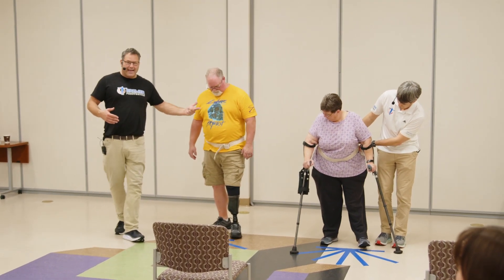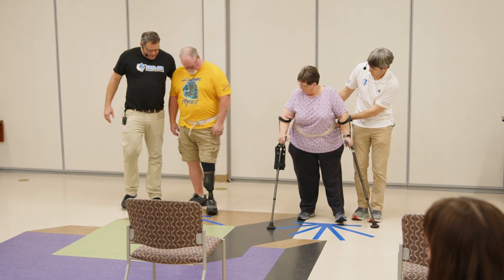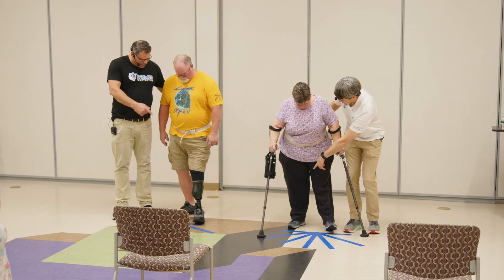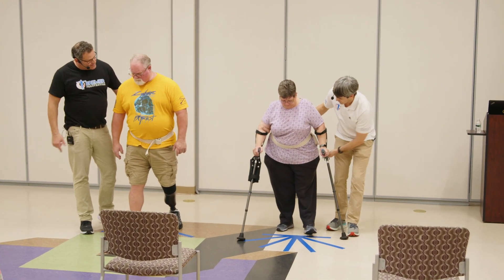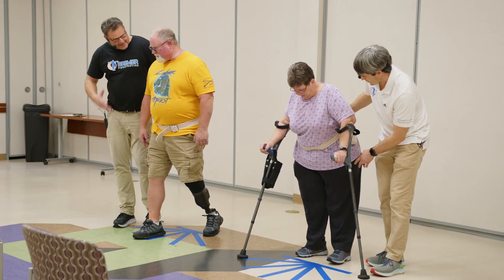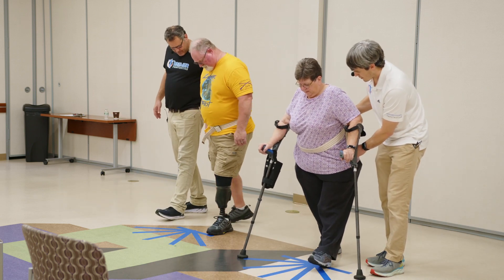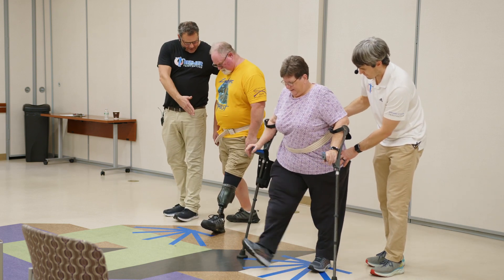It's not about striking the sound limb — it's about using the prosthesis to pull your weight through. So go ahead, just start with the heel forward. Without pushing off on the other side, pull through and take a step. Does that feel really exaggerated on those same muscles you were using to do the heel strike? Yeah, it feels like a very exaggerated version. Now try it — get your other leg behind you more. Start with the heel like that, because remember you're taking off from heel strike.